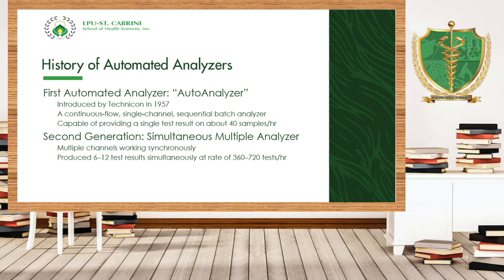Okay. Next we have the second generation, or the simultaneous multiple analyzer, which allows the testing of 6 to 12 tests per sample simultaneously at a rate of 360 to 720 tests per hour, which is much more efficient than the auto analyzer. And remember, we have here the SMA6 and the SMA12, which are both capable of multiple channels for different testing.